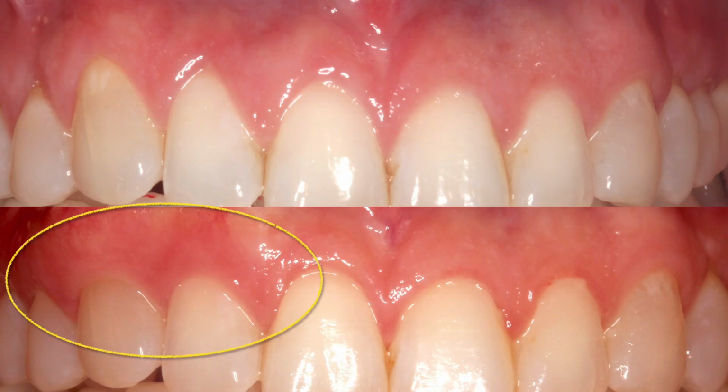So here it is. This is one of the magic of what connective tissue graft, or specifically subepithelial connective tissue graft, one of the most commonly performed soft tissue procedures in the contemporary world, and one of the most commonly used application, and that is to get root coverage and to thicken the lost tissue.